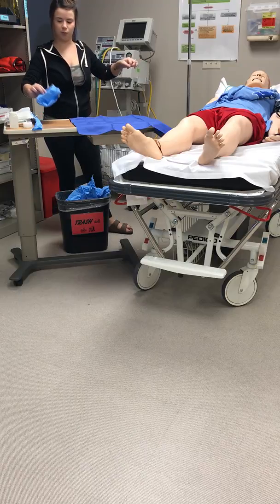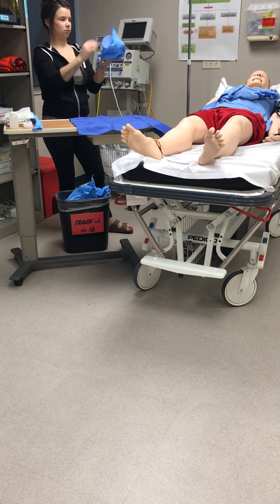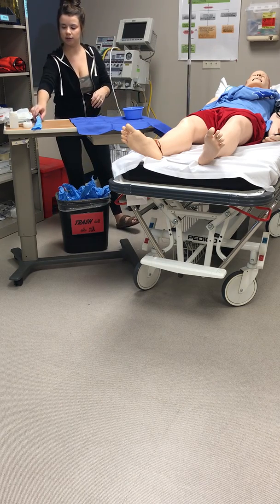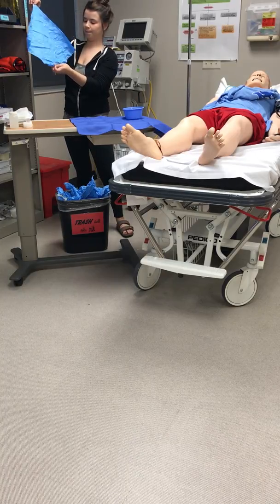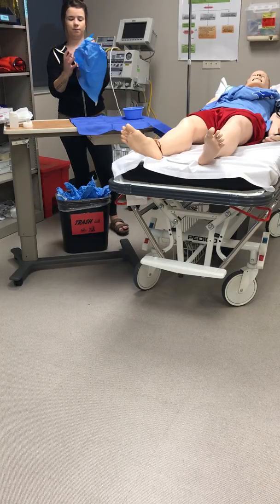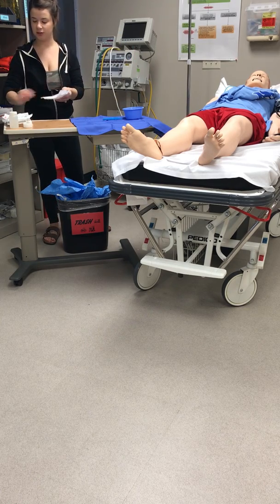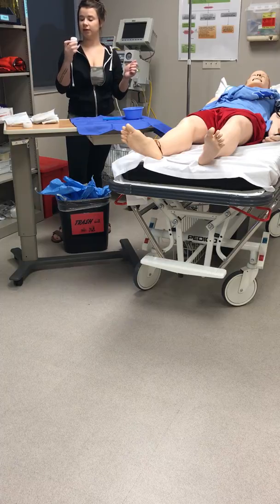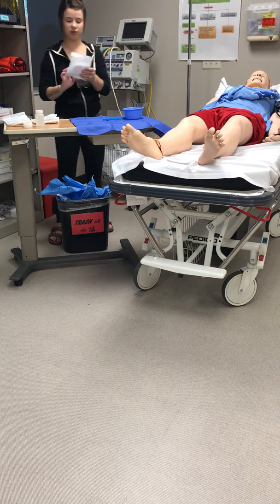Alright, and now I'm going to go ahead and open up the bowl. And the instrument. And then all of my packages are closed and sterile, so they're ready to be used. My saline is normal saline. The expiration is in 2020. So I'm going to go ahead and open up my packages then.